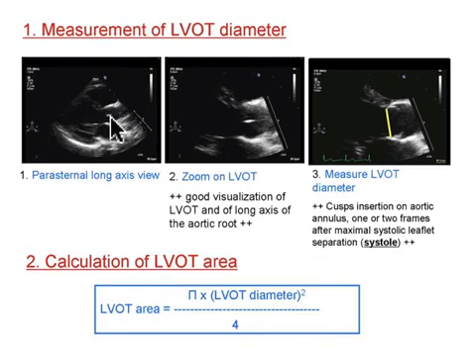And actually right now, I can tell that this aortic valve, when the leaflets come together, they have that little white line at the tip of my arrow. You can see that little white line. That's the leaflets that came together. And so that's during diastole, the heart's filling, those leaflets are together. Now, this is just a frozen and zoomed in version of that exact same valve.